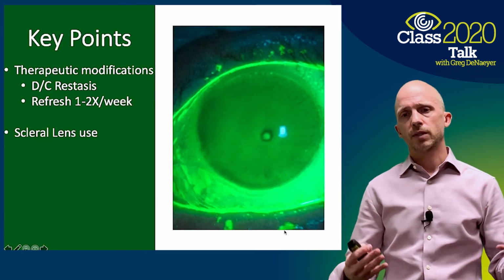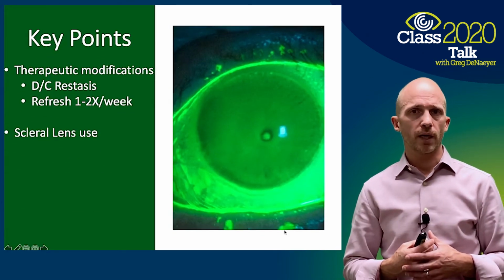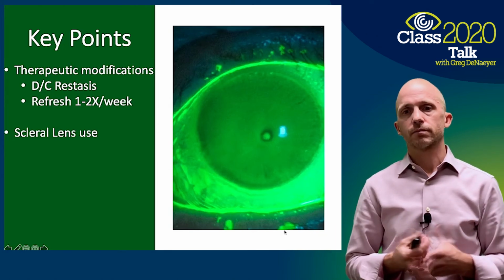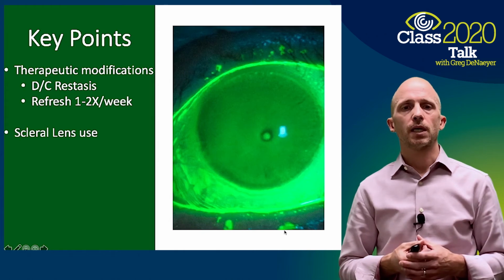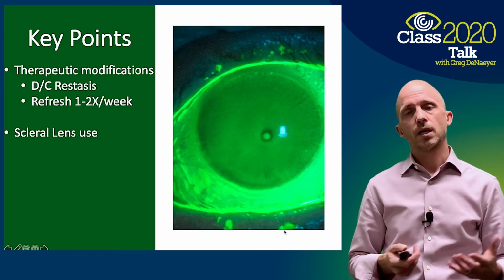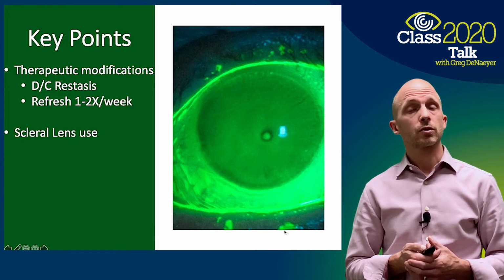Key points: this patient was actually turned over to me for my care from that ophthalmologist. I stopped his Restasis because it really wasn't helping him, and he continues refresh drops pretty much as needed, but he, of course, continues to wear the scleral contact lens quite successfully.